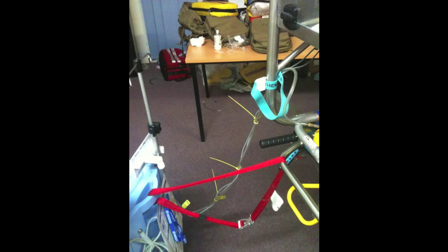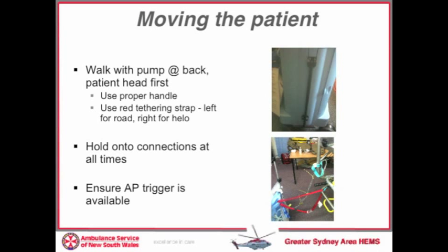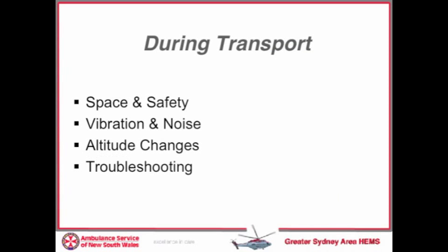When moving the patient, remember to use the red tethering strap at all times. It's also recommended to use bag ties to connect the driveline and the leads together, which reduces risk of snag and therefore disconnection. It is advised to walk with the pump at the back, and as always it is the doctor's role to be vigilant, watching the connections at all times.